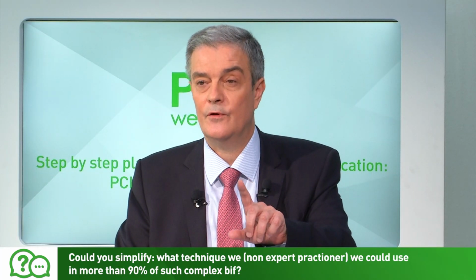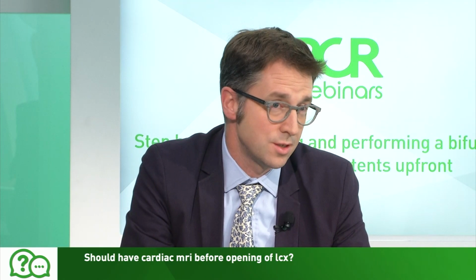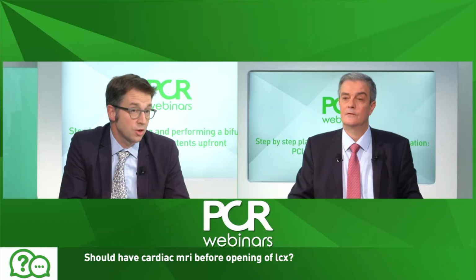One question before we switch to your strategy. Should we have had a cardiac MRI before opening LCX? It's just 5 days. So it's a good question in terms of viability. Is there a need for us to open the circumflex? The echocardiogram was fairly compelling for the fact that there was remaining viability in the circumflex territory. The patient hadn't changed in terms of their status in that time, but it's a valid comment.